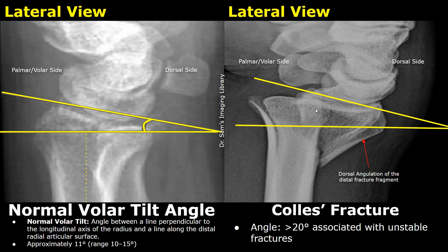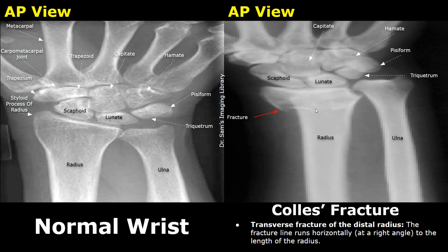Here is another case of a Collis fracture. A transverse fracture is present in the distal radius. It is also an impacted fracture because we see overlapping of the distal fracture fragment on the radius. The radial height is significantly reduced indicating radial shortening, and the radial inclination angle is also severely reduced.